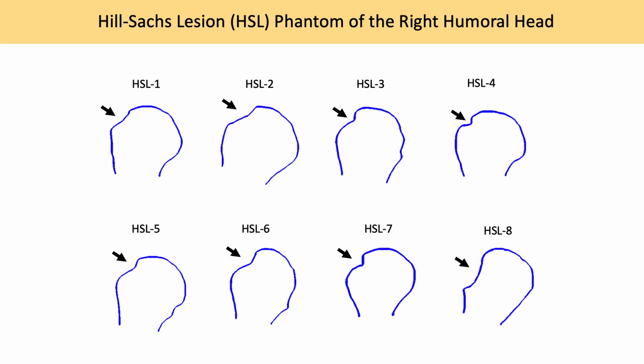I went into the literature to look at the various shapes of Hill-Sachs lesions and then created a number of phantom lesions in order to provide proof of concept. Here are a series of Hill-Sachs lesions, with arrows pointing to the lesions at varying degrees of severity.